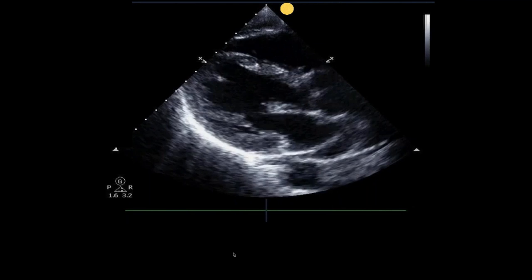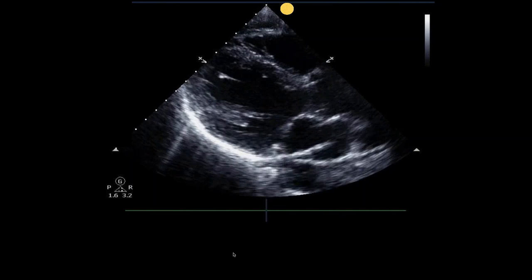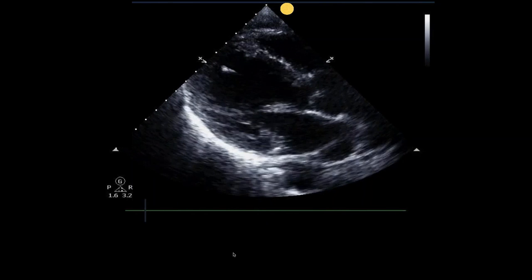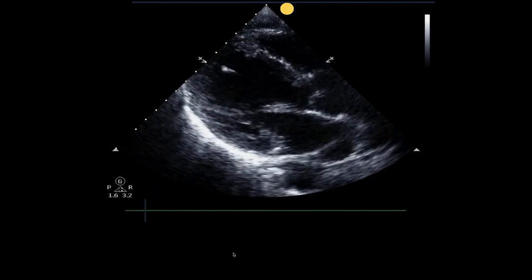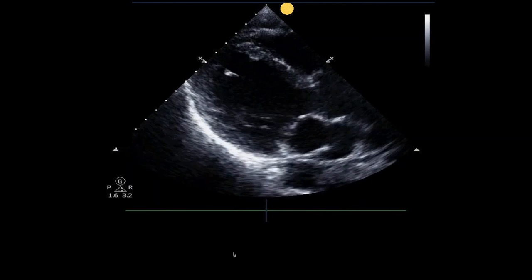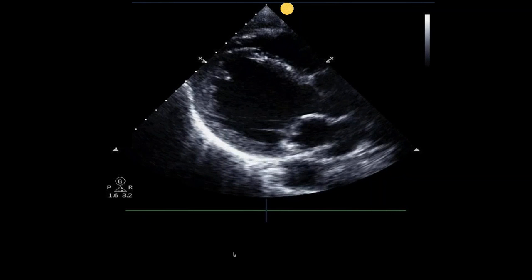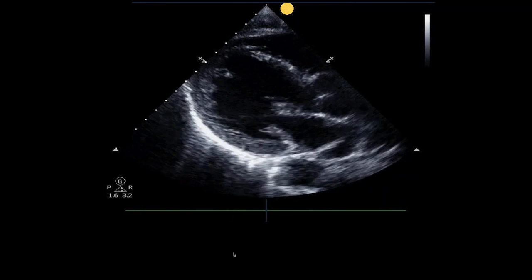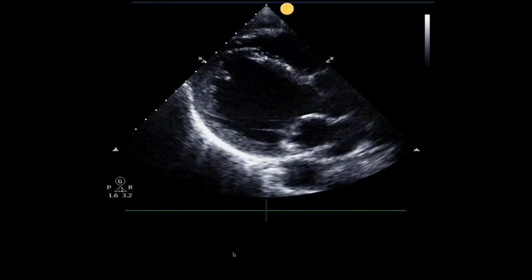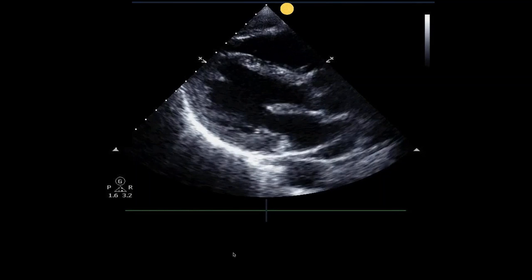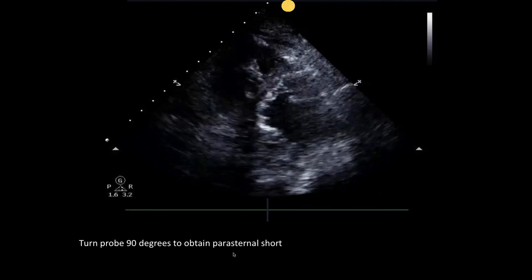Here's another view of parasternal long — you can see all those components of the heart, how it's squeezing, and get a nice shot of the mitral valve and septum. You know you've got the right cut when you can see the valves line up with the ventricle, atrium, and aortic outflow tract. If you're in an oblique view and start making calculations, you'll be underestimating or overestimating the ejection fraction.